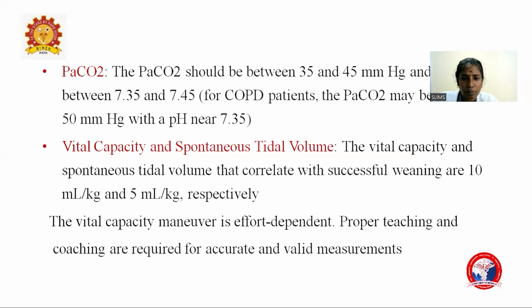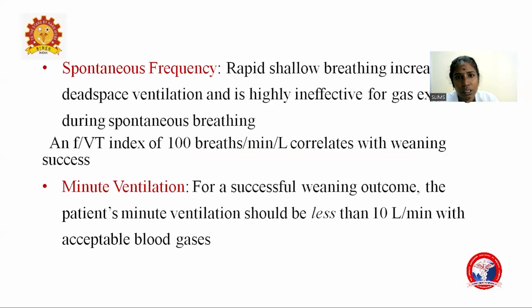The vital capacity maneuver is effort dependent. Proper teaching and coaching is required for an accurate and valid measurement. Then moving on to the spontaneous frequency, that is rapid shallow breathing. The index also plays an important role. The dead space ventilation is highly ineffective for gaseous exchange during spontaneous breathing.